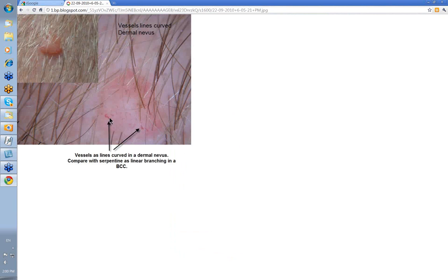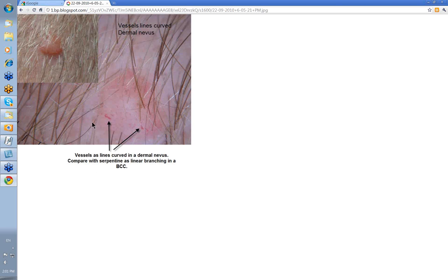We were talking before of curved vessels being a feature of dermal nevi or of some congenital nevi and Unna nevi. This is a dermal nevus. You might look at that clinically and think it's a BCC, but once you stick your dermatoscope on it, you see these curved vessels — that's a dermal nevus. Whereas you'd get the serpentine with linear branching in a BCC.